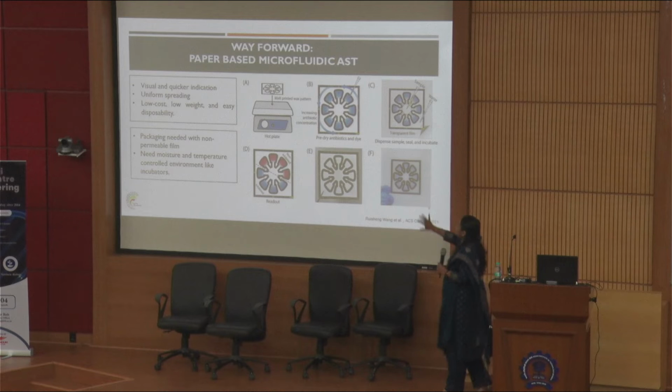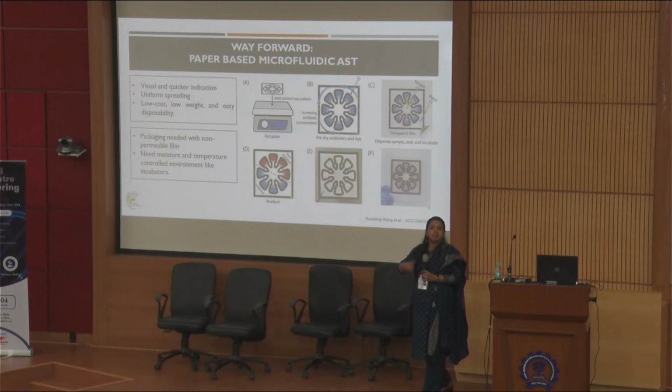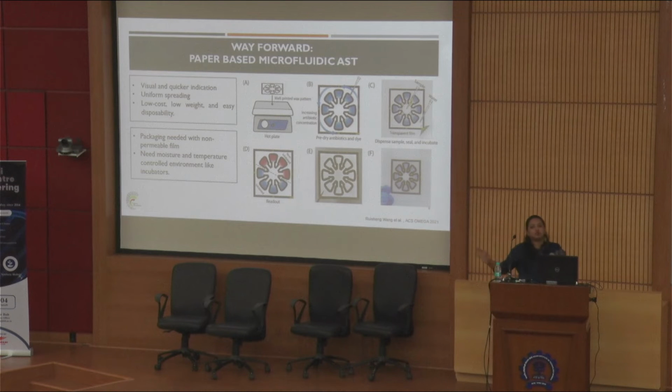But what happens in these devices is, because it's a paper, if you leave it in the open, it will dry up. And when something dries up, the nutrients are not there, so bacteria will anyways dry. So they need a lot of packaging, many of which is non-biodegradable. So there's another problem here in this device. Paper is biodegradable, but when you have a plastic packaging around it, it is not easy to dispose of.